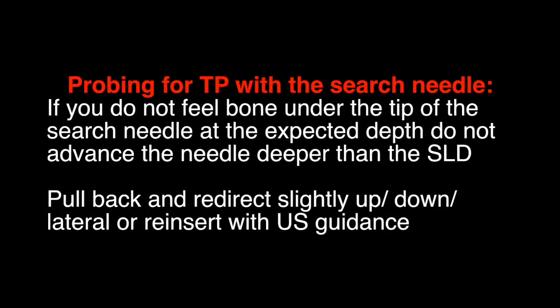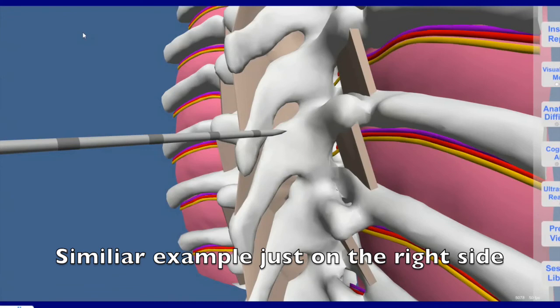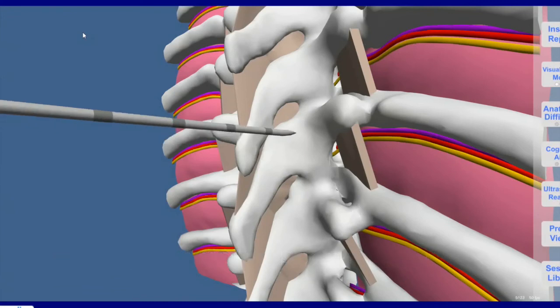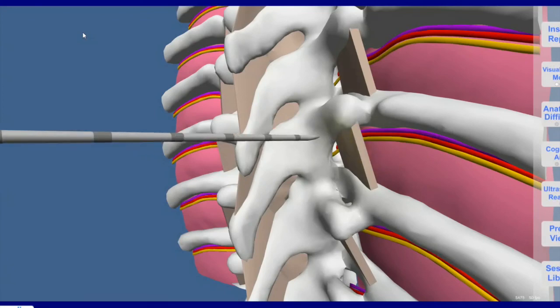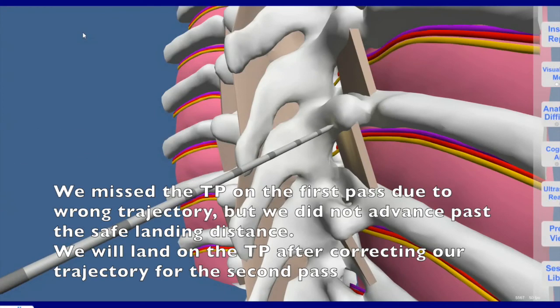If you do not feel bone under the tip of the search needle at the expected depth, do not advance the needle deeper than the SLD. Pull back and redirect slightly up, down, lateral, or reinsert with ultrasound guidance. We missed the TP on the first pass due to the wrong trajectory, but we did not advance past the safe landing distance. We will land on the TP after correcting our trajectory for the second pass.